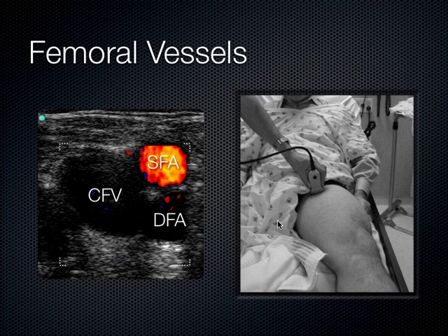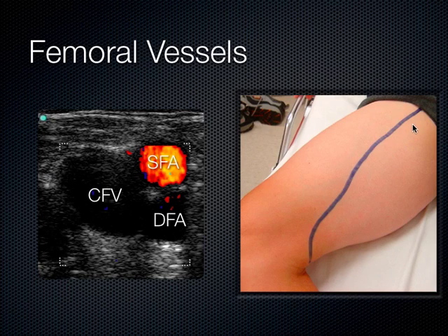Very good, the left leg. The other way you can look at it up here in the picture, they're scanning the patient's left leg. Very good, excellent. And so what's happening is this femoral vein I drew here on my fellow comes down his leg here, and it was a little bit awkward, but it comes down his leg and dives in the superficial femoral canal. This is where it's really hard to insonate or to view.